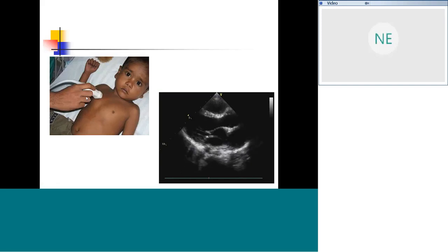Coming to the parasternal long axis is the place where there is a little difference. And you can see here the long axis is made like this, from the left shoulder to the right hip, which is across the axis of the heart. This is for the mirror image dextrocardia and also for dextroversion dextrocardia. So it is exactly 90 degrees compared to a normal heart in levocardia. So in the parasternal long axis, if you put the cursor like this, do not change the buttons anytime. The upside down, the left right button, do not change. You will see a heart like a normal heart.